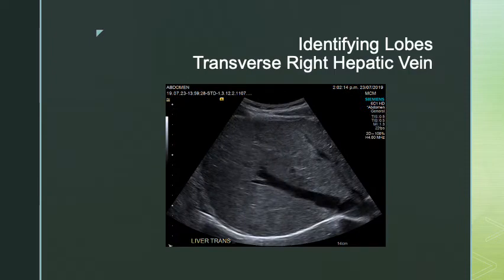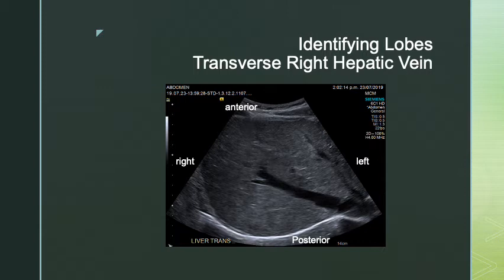Here we have a transverse image at the level of the right hepatic vein. With image orientation of right, left, anterior, posterior — for the right lobe we have anterior and posterior segments. My right hepatic vein is what divides anterior from posterior. So I have segment seven, which is posterior and superior, and segment eight, which is anterior and superior.